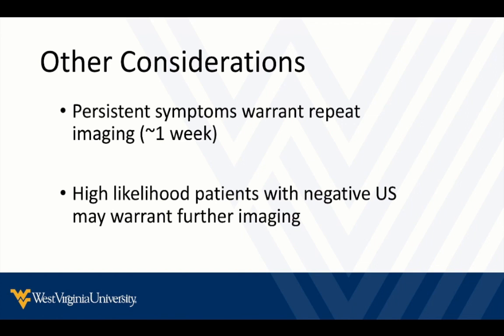The one thing I'll say about that is patients who have big purple legs with a clot, their clot burden is generally extensive, and we're usually going to find it with point-of-care ultrasound. I don't really have great literature to back me up on that, but that's my general sense of patients I see. I don't worry too much about missing the clot in the purple leg.